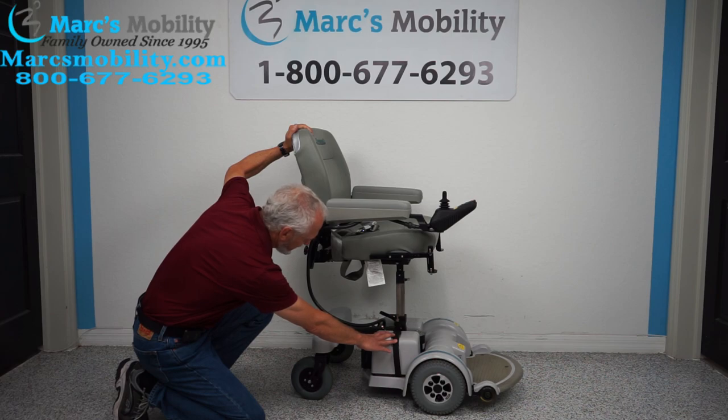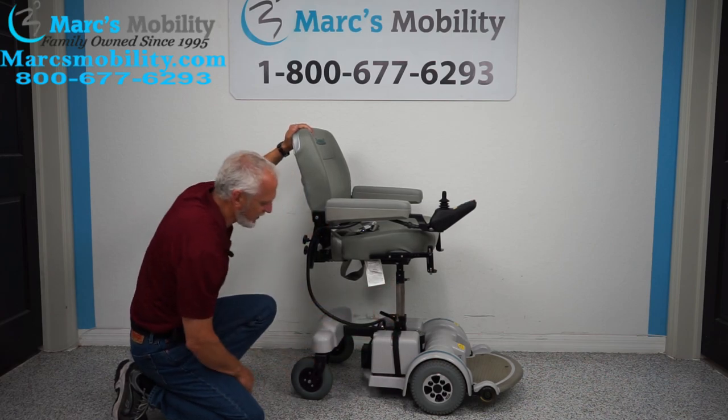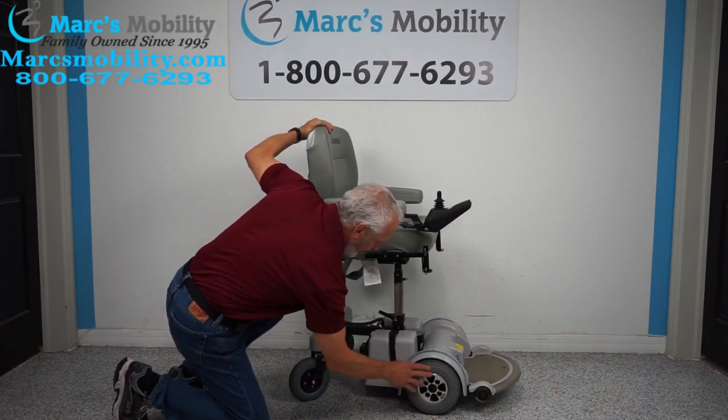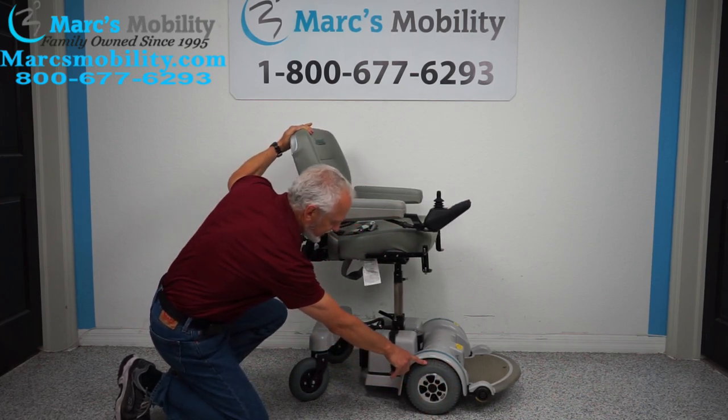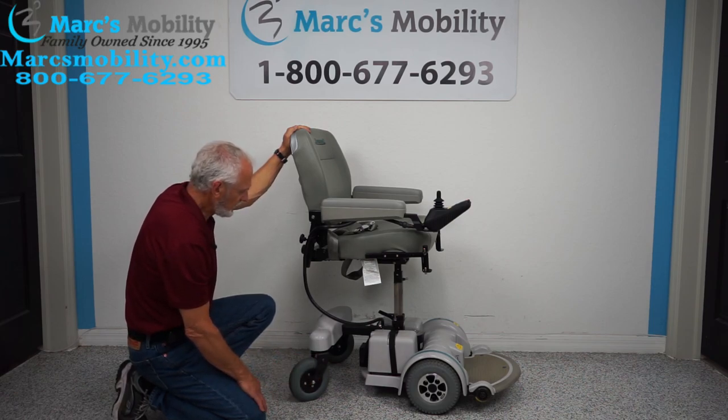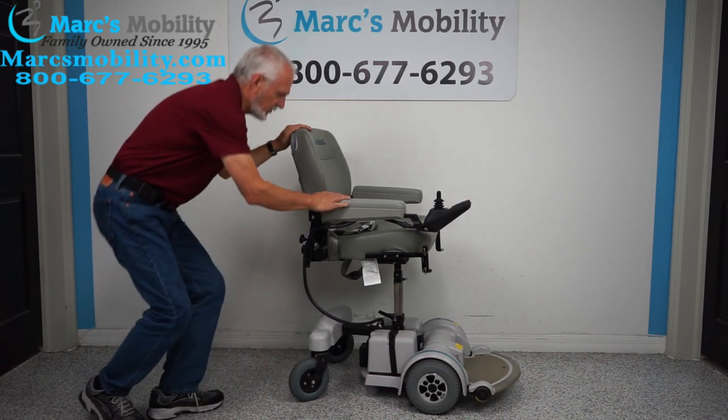You can see the batteries for the chair right here. The seat lift is between the two batteries. You have caster wheels in the back. These are the original tires — they look pretty new. These are nine-inch tires, they're kind of knobby, and then you have a seat on here.